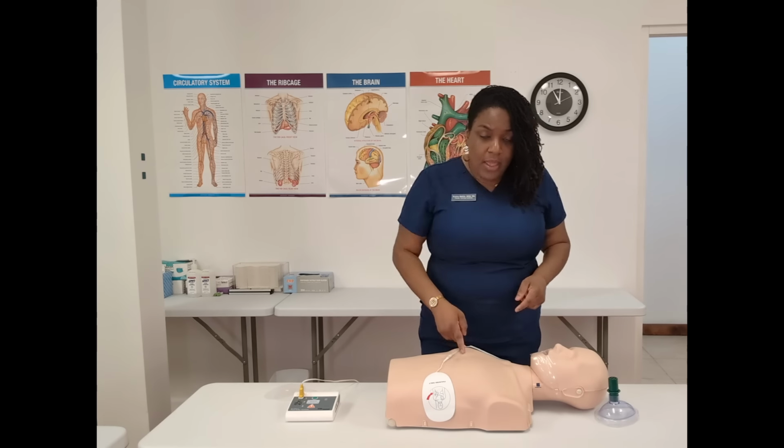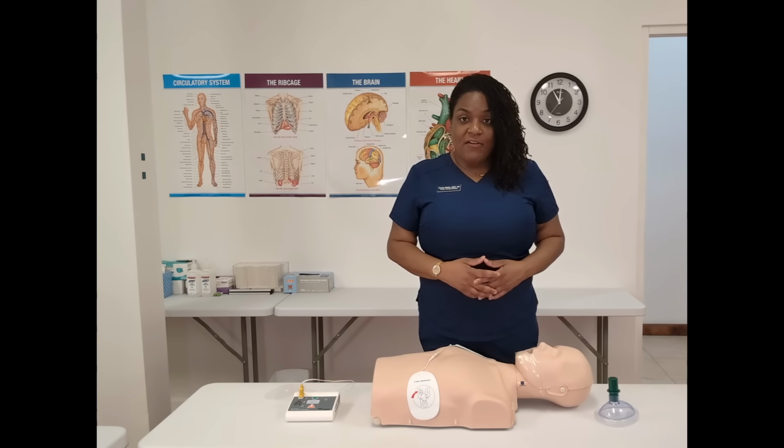You can also use 1 or 2 hands with a child. If it's a really small child, and you are okay with compressing with your one hand and you're sure that you're getting down 2 inches, do the one-handed technique. However, I don't have enough upper body strength with just one hand, and I want to make sure that I'm giving this child the best chance at survival. So I'm still going to use 2 hands when I'm performing CPR on a child victim.